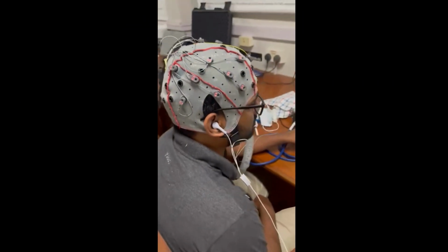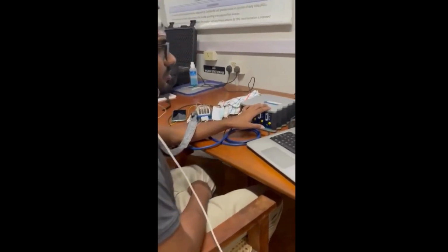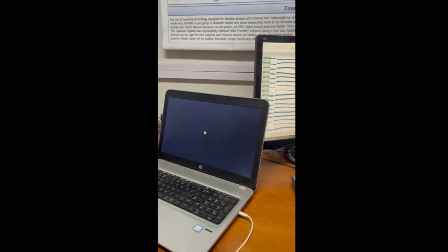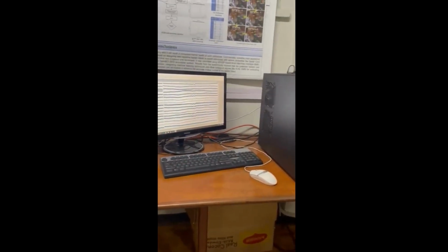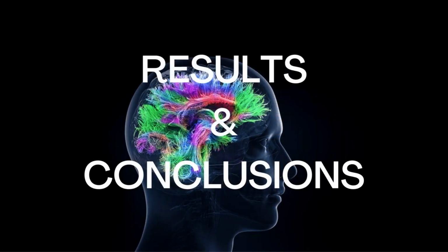With the ethical approval granted from the University of Moratuwa, we managed to collect a dataset for 6 and 16 channel montages with 120 trials each from 33 subjects. The experimental paradigm contained both visual and auditory stimulus.